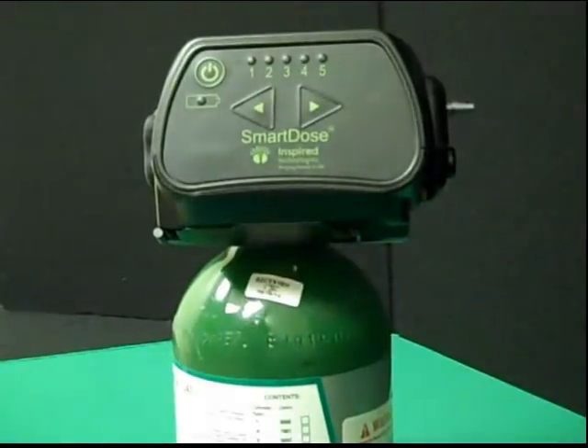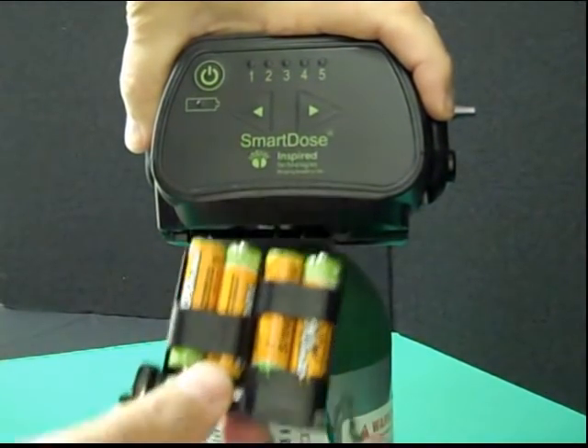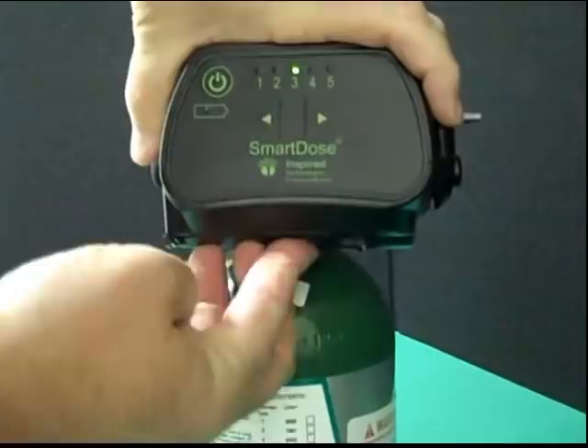To remove the batteries for charging, simply squeeze the battery release clips together and slide the battery holder out of the unit. Batteries can now be easily charged. To reinsert, simply place the batteries in the holder, paying attention to the polarity markings, and reinsert into the SmartDose unit. Push to clip the holder into place.